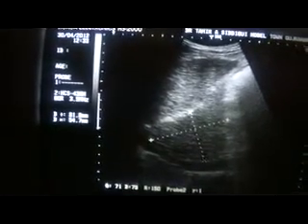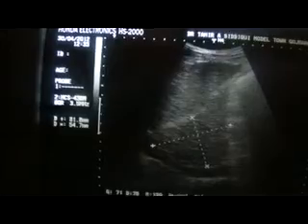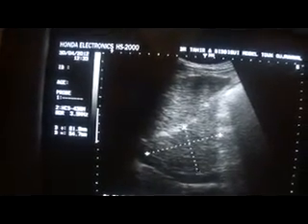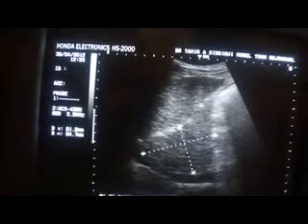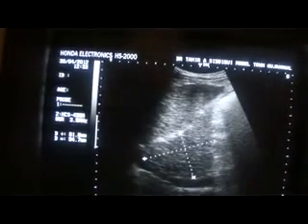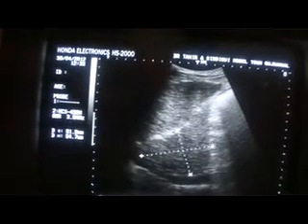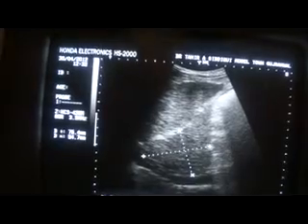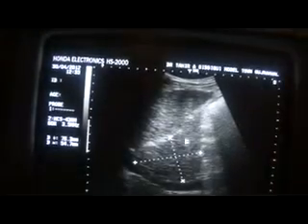This is hyperplasia of the caudate lobe, and this is not an unusual finding in a cirrhotic liver — advanced stage cirrhotic liver. You can see the coarseness, echogenicity, and outer surface irregularity of the liver.